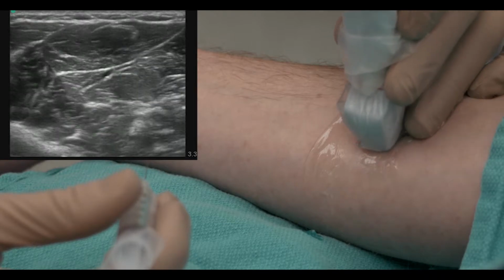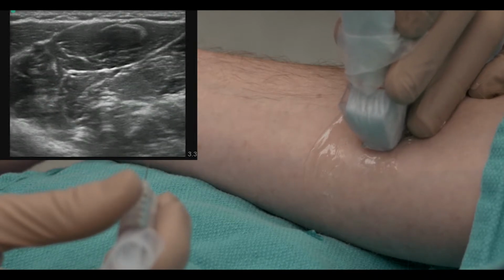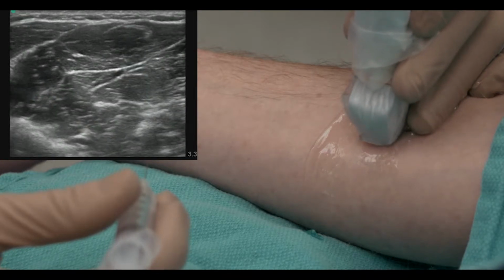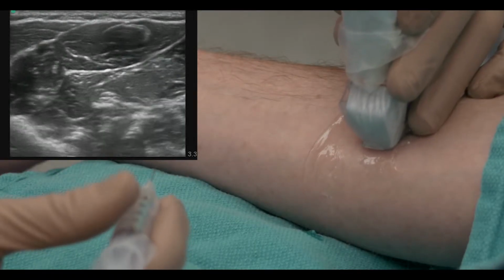And then I'm going to sweep back and forth. When I'm exactly perpendicular to it, as I am now, it shows up quite nicely, but if I come off just a little bit, you can see how it disappears. So we want to get the best possible view, and then from there you want to decide which direction you're going to come at the nerve from. You can either come from the radial side or from the ulnar side to get that median nerve.